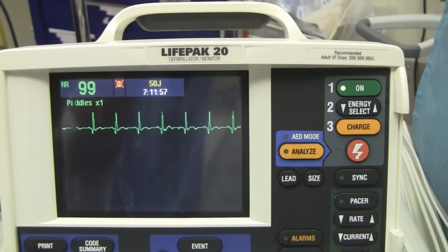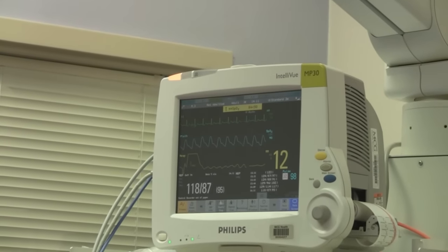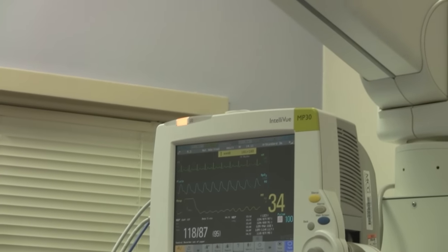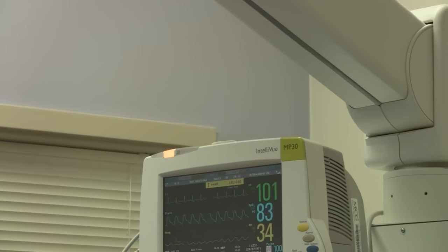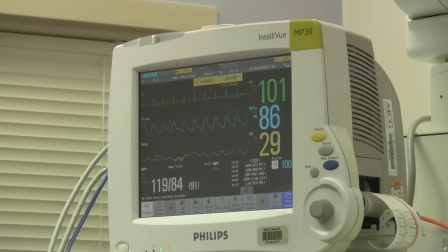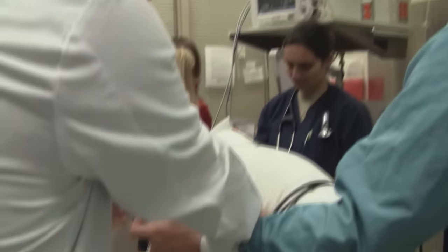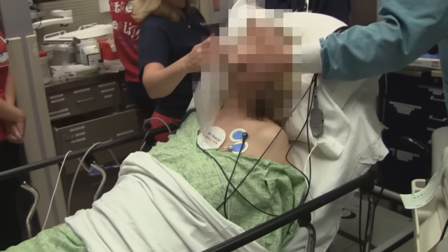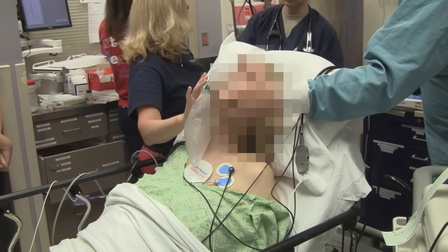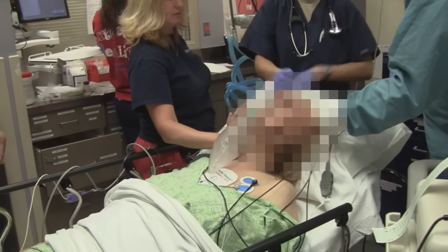Heart rate — on your heart rate, yeah. 82. There you go. Take a little oxygen. There we go. There you go. We're done. Coming back. All right, we're coming up. Hey there.